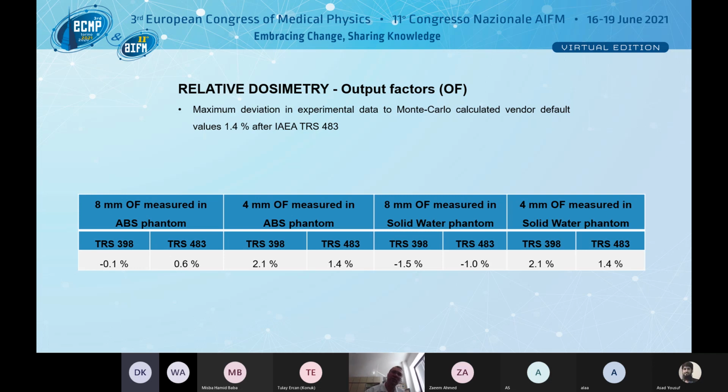Scintillation detector is the new kind of detector, which is supposed to be a good one. And as far as I know, the MOSFET was also used for measurements. Tiny little TLD rods or small alanine dosimeters, I'm not sure.